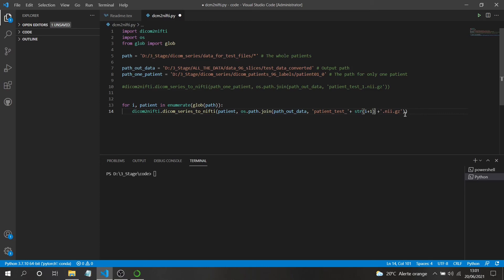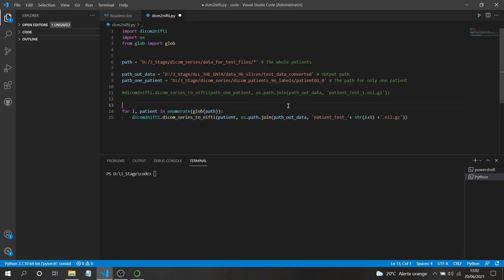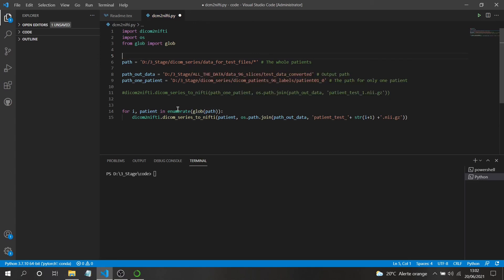Before running, I'll mention the tqdm library. If you run the loop without any progress indicator, you won't know which patient is currently being processed. You can wrap the iterable with tqdm to get a progress bar showing conversion progress. For only six patients we don't really need it, but for larger datasets it's very helpful.